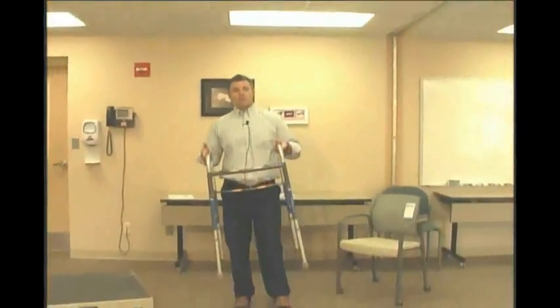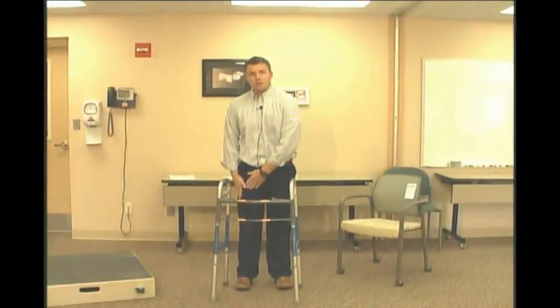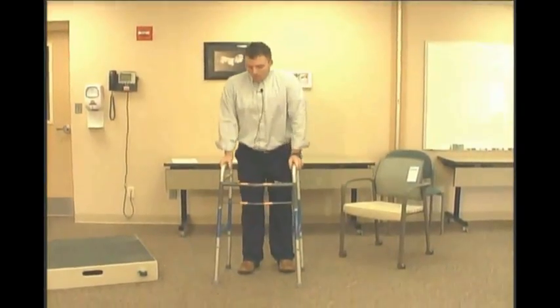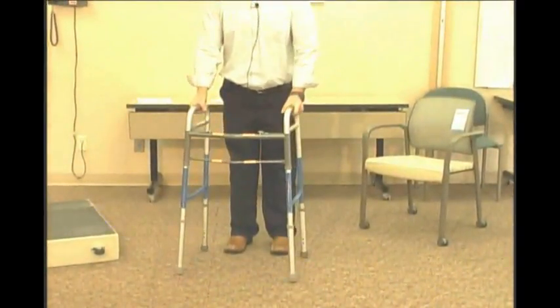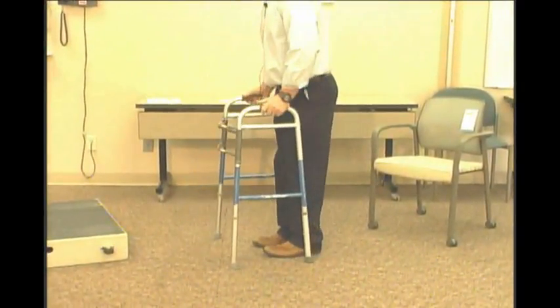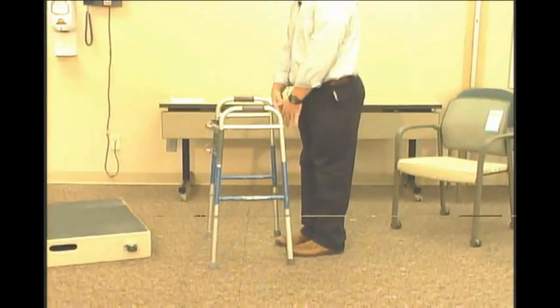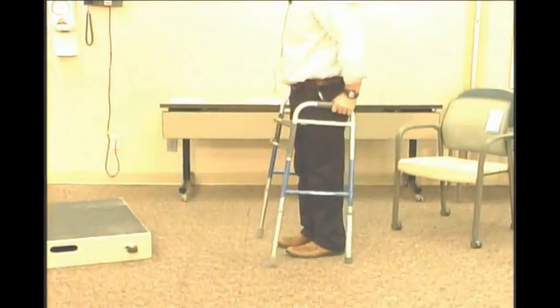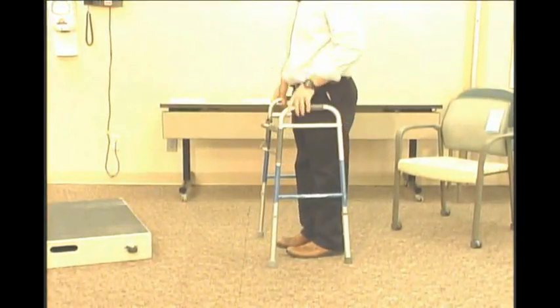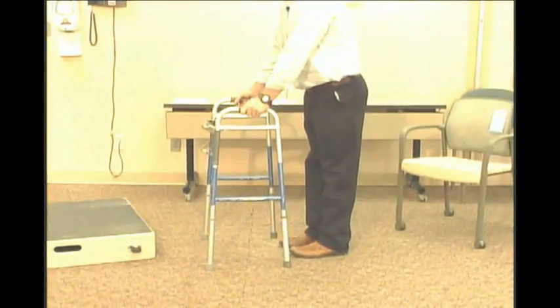A, like I said, we'll start with how you'll be walking using this standard walker without any wheels. So for this demonstration, I'll say my surgery was on my right leg. With this walker, when I'm standing up, I move the walker in front of me, and I'll turn so you can see. I'm moving the walker in front so the back posts are lined up with my toes. You don't want to be reaching way out because you lose the safety of the walker, but you don't want to be too close either because it loses the stability component. So I've put my walker out a good distance in front of me.